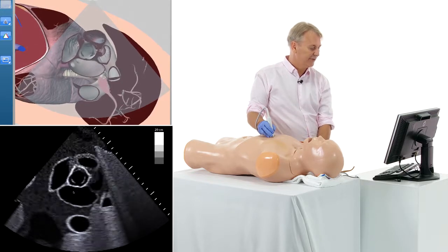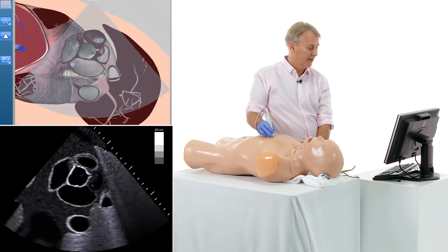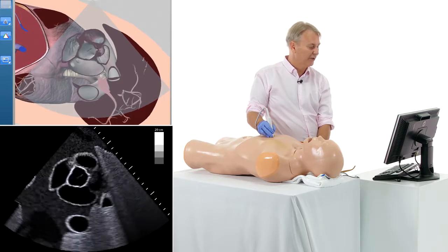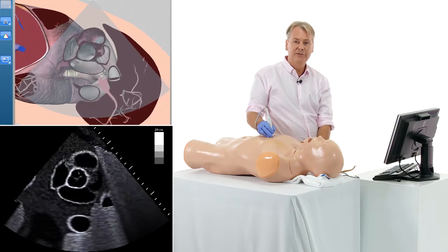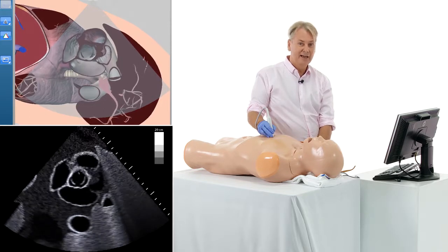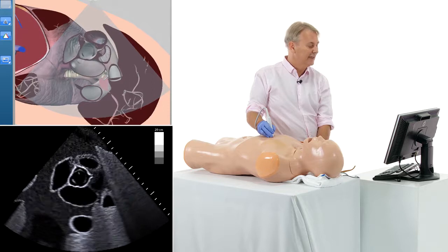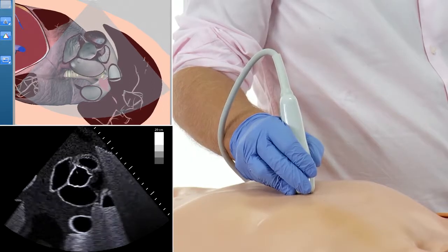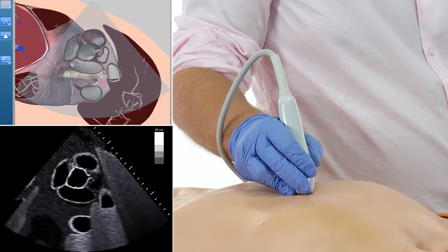Right here, this cusp, which is close to the interatrial septum, would be the acoronary cusp. The cusp which is close to the pulmonary artery is the left coronary cusp, and the one which is close to the right ventricular outflow tract is the right coronary cusp. And once you identify this cusp, it's also easy to tell which coronary arteries leave the aortic root. Here this would be the right coronary artery, and right here is the left coronary artery.